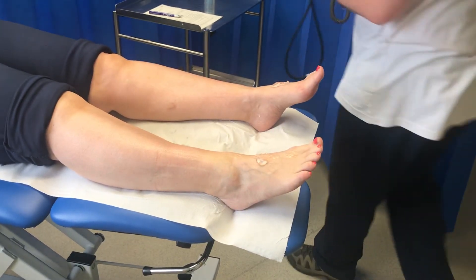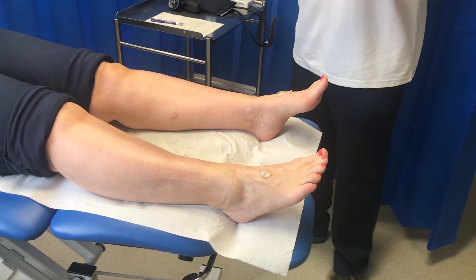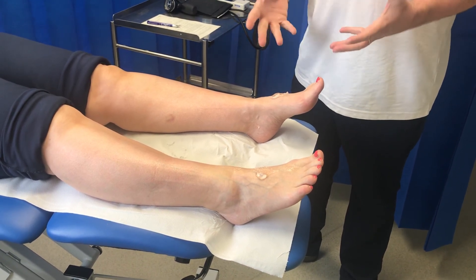We've now completed the ankle brachial pressure index test. We'll make a record of the results, work it out, and consider it in the context of the clinical problem presenting — be it claudication, rest pain, or a wound on the foot or leg.